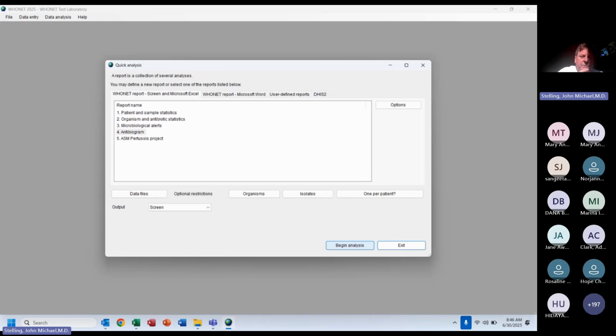That's the standard screen Excel antibiogram report I've shown you. That's new since about 2 months. And now we have the new Word report. So first I'll do, what time is it? 8:47. We're still good on time. I'm going to do the epidemiology report that I hope many of you know. We've had this for about 3 years. So first I'll do this antibiogram report.